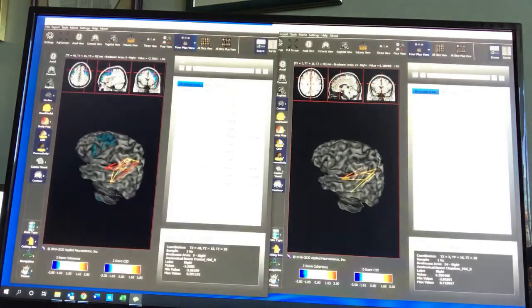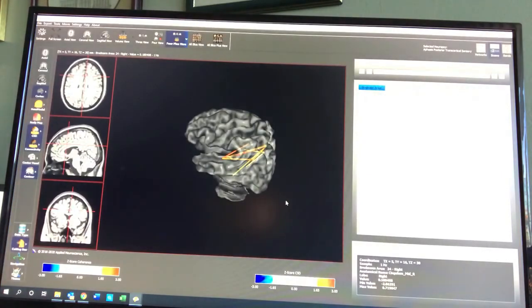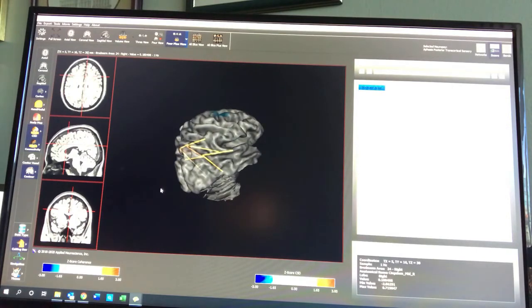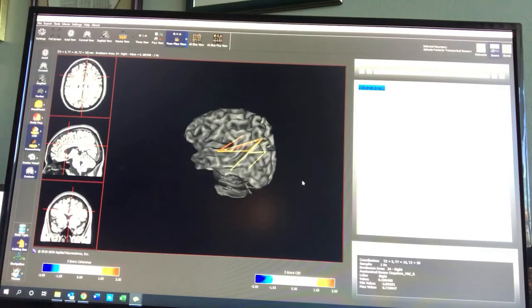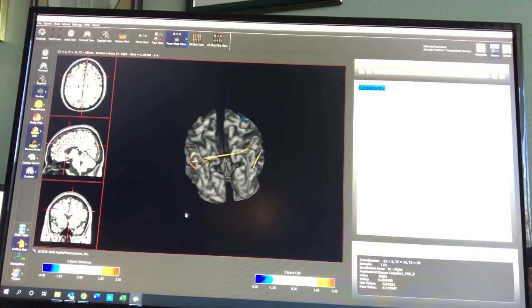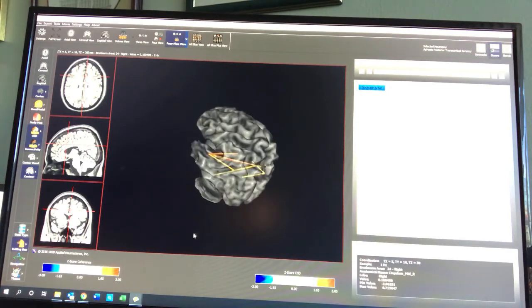Now I'm going to bring this image back down so we can see what happened after 10 sessions of LORETA Z-score neurofeedback. Well, at 1 hertz we can see a tremendous change in that affected area in the delta frequency of 1 hertz that has become normal, and what we've seen in the sharing of information and the connectivity has reduced tremendously. So a lot of those connections have cleared up, and that's extremely positive. We do see a little bit of blue still up here, meaning that this area still needs some of that deep sleep frequency of 1 hertz.